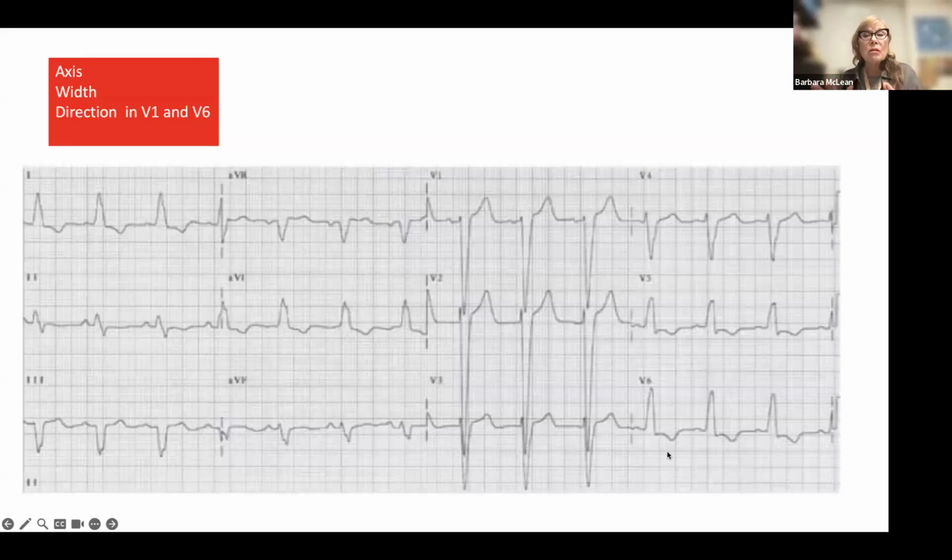Now, the discordance of the ST and T wave are only in the leads that are really looking at the side where the bundle is blocked. So lead 1, AVL, V5, V6, all severe left-sided leads, all have ST downslope, T wave inverted in a discordant pattern. I don't expect discordance anywhere else, and I don't have it.